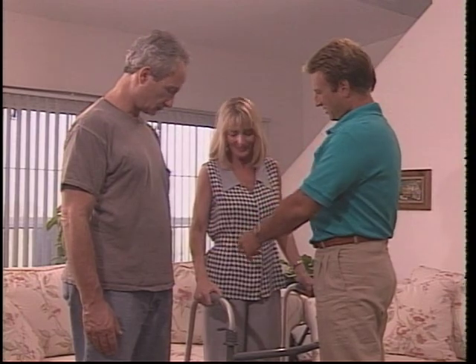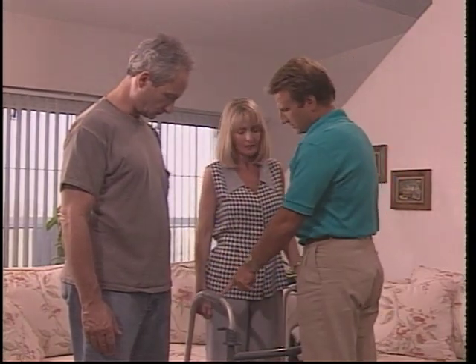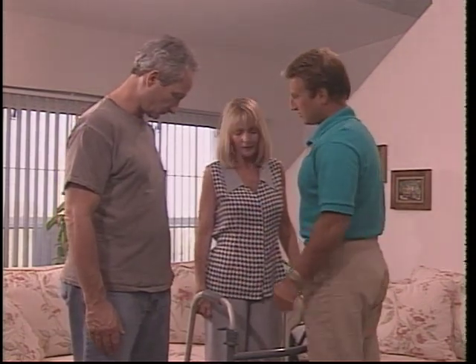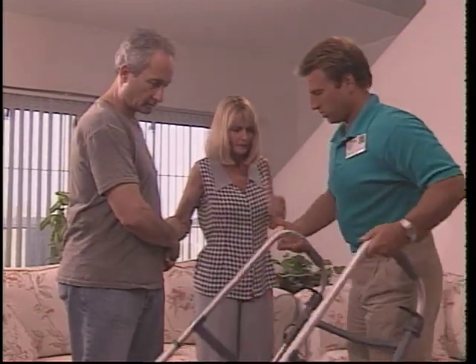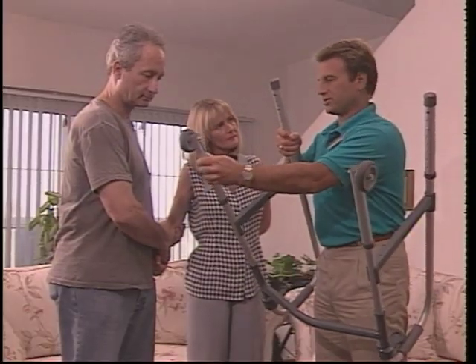Okay, relax your arm, Beth. That's good. Now what I'm going to do is adjust the height of the walk aid so it's even with the break in your wrist. Alrighty? Okay, you hold her arm, please. Alrighty. Might need to adjust it just one or two. Walk aids can be used when more stability is required than can be obtained through the use of, say, a cane or a crutch.